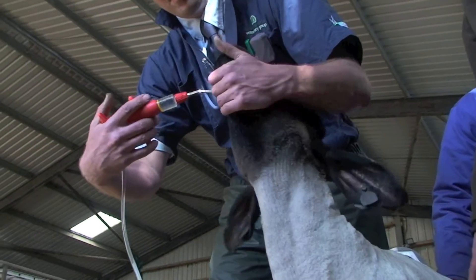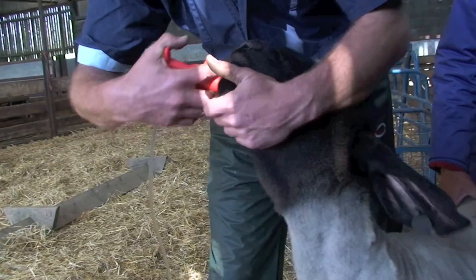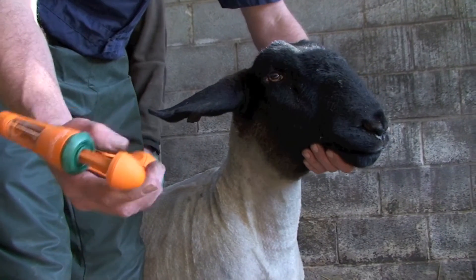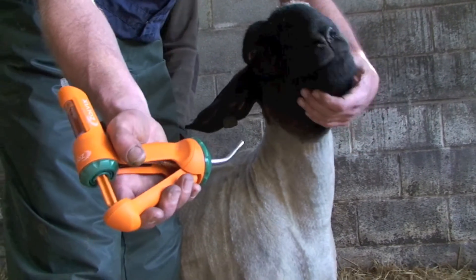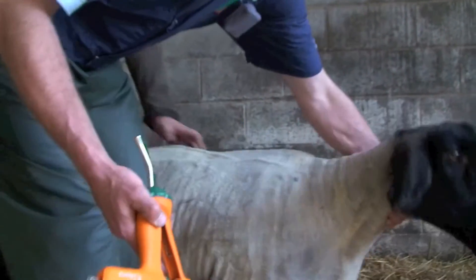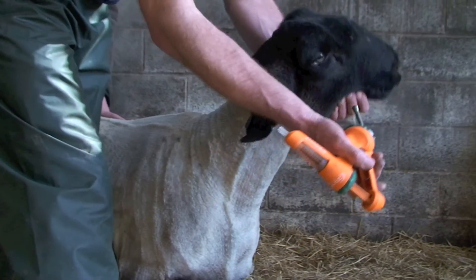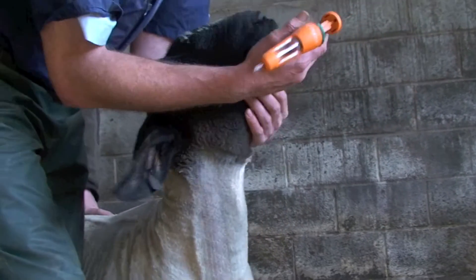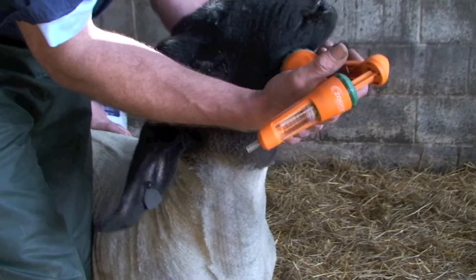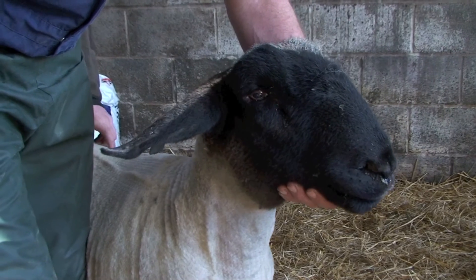You put the nozzle over the back of the sheep's tongue, holding the jaw, and administer the drench. There's a new drench gun — the Opti-Line drench gun — now on the market which makes it even easier to get in the correct spot and also avoids any injury to the ewe. You can't go in too far; placing the nozzle over the back of the sheep's tongue positions it in exactly the right place to deliver the drench. This is well worth having.